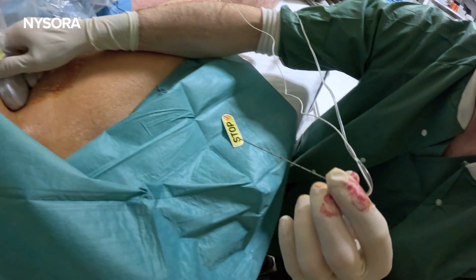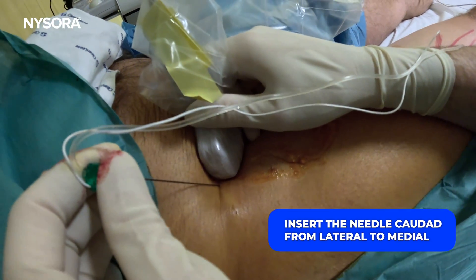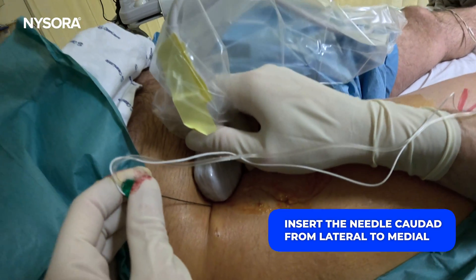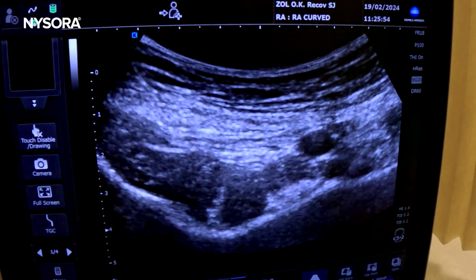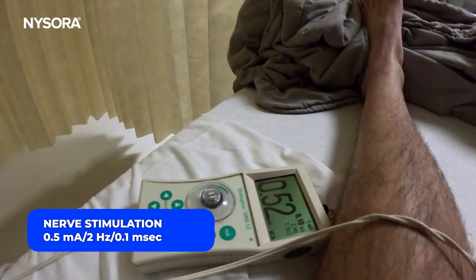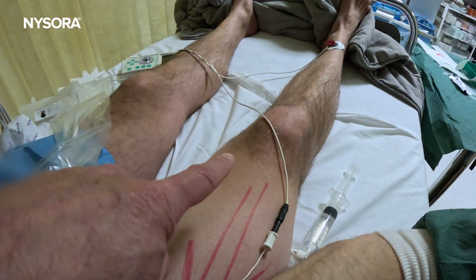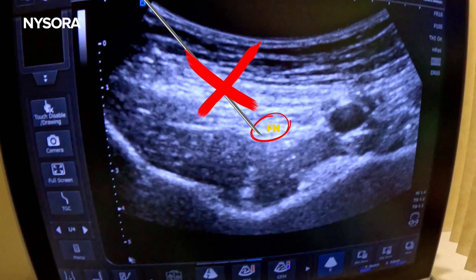With the slight caudal tilt to emphasize the iliopsoas tendon, placement of the needle goes in a caudal direction from lateral to medial — always a slight caudal direction in order to avoid the needle entering the pelvic cavity. We routinely use nerve stimulation here because it is so easy for the needle to enter the femoral nerve. If you get an unexpected motor response of the patella, you know that your needle angle is wrong.